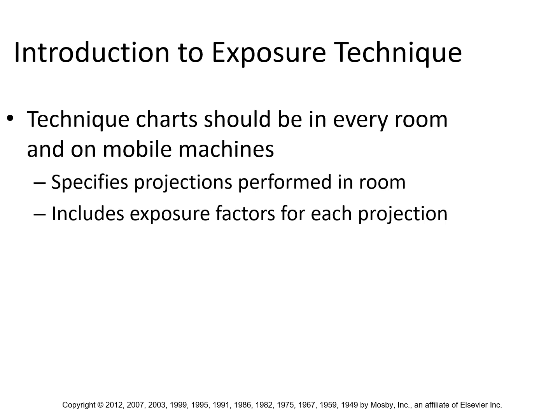And that's up to the department manager and whoever's purchasing the equipment from the manufacturer. Make sure as they're doing applications, they're actually testing the APR techniques on phantoms and demonstrating that, yes, in fact, these are diagnostic techniques and they don't overexpose the patient.